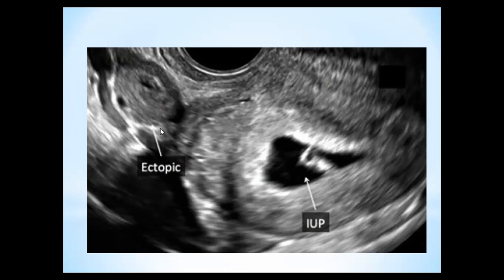It is very important to look at the ovary on both sides and look for any lesion beside the ovary. Here, there is a lesion which has a thick wall — not a picture of the ovary — and an anechoic area inside it. We should be suspicious of an ectopic or heterotopic pregnancy. There is an intrauterine pregnancy, and this is an ectopic component of a heterotopic pregnancy.